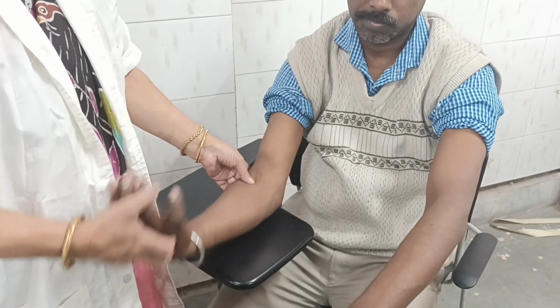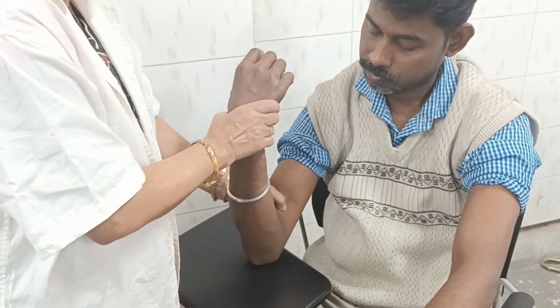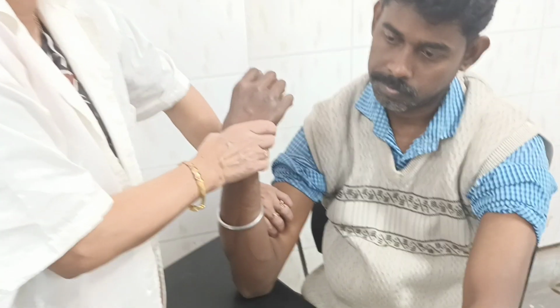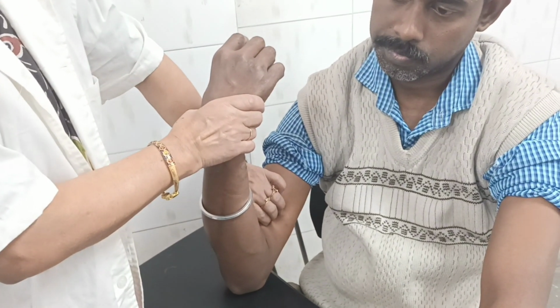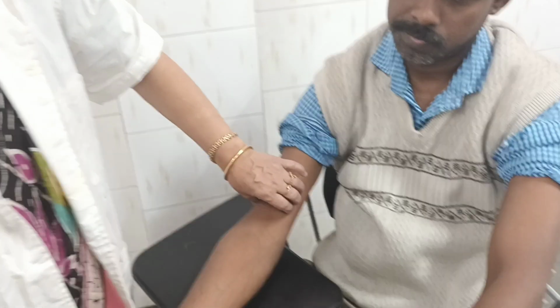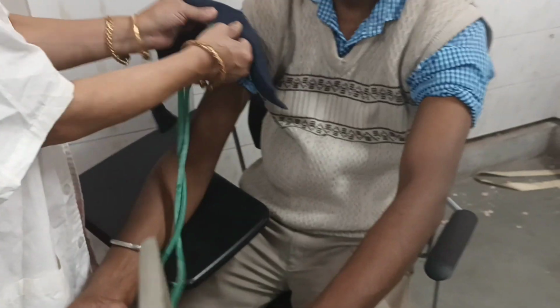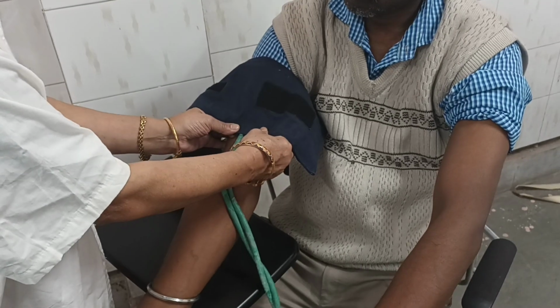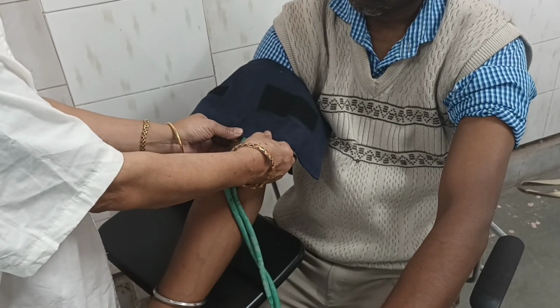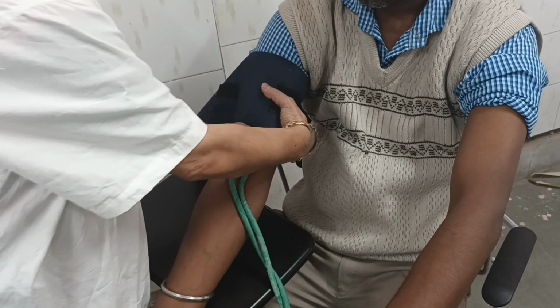Ask the subject to bend his elbow. Now, medial to that, you feel the brachial artery. You have to place the chest piece of the stethoscope over the brachial artery. For this reason, you first hold it like this. Place it over there. The cuff should be in front or on both sides of the brachial artery. Now, like this.